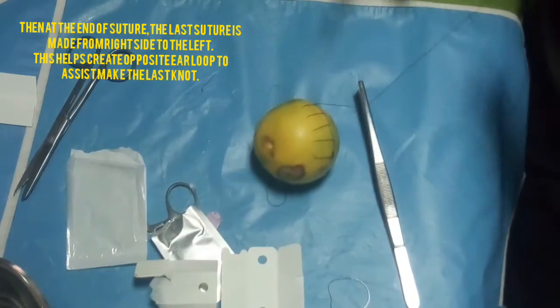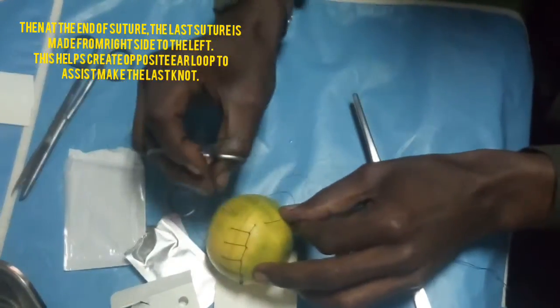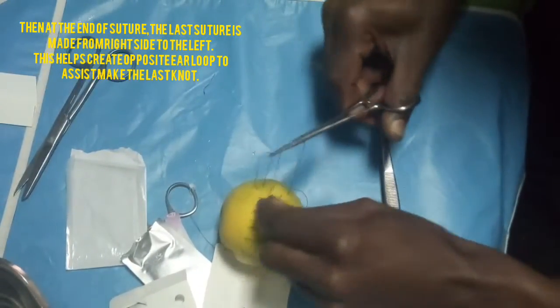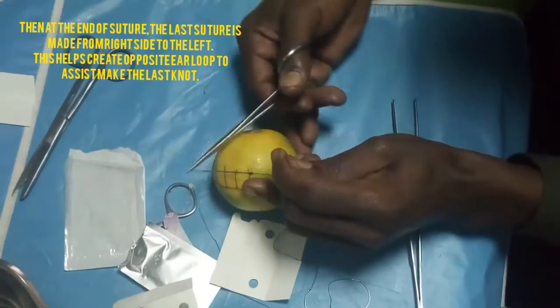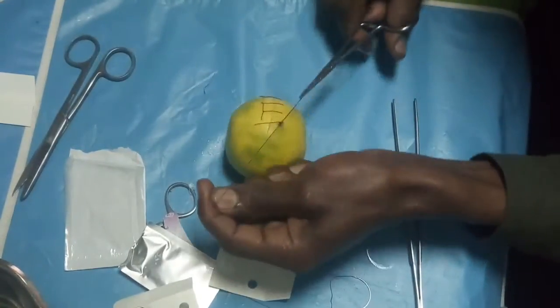Then you fold. Look carefully at the last knot. You have left something that looks like this. You count 1, 2, 3. You clamp, you do like this. The other one, you count 1, 2. You do like this.